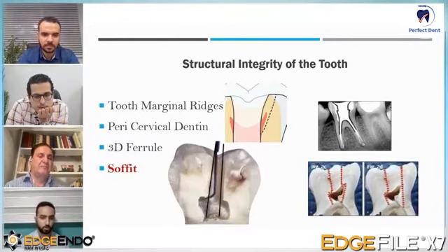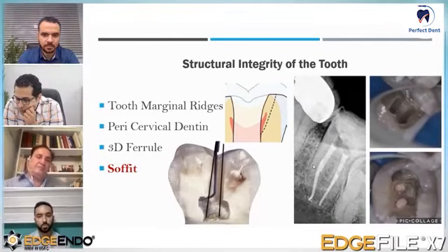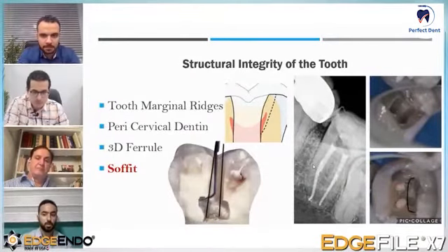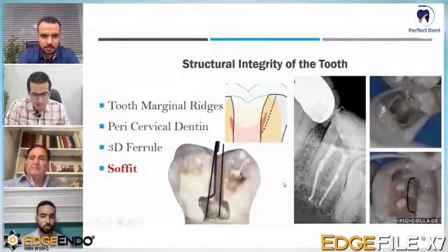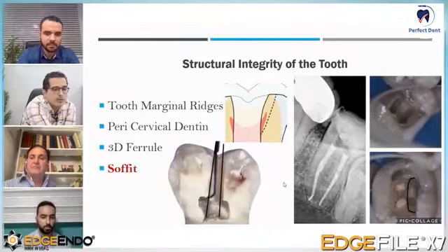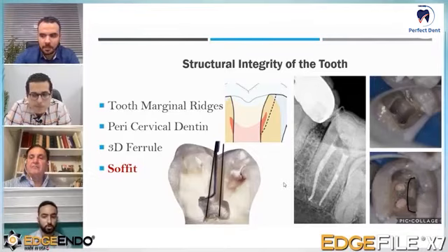So if you have a chance to preserve it and still have your straight line axis, it may preserve lots of dentine. Like for example, in this case, I had the lower second molar. I didn't know from the beginning if it's only 2 canals. So maybe if I know from the beginning, from a cone beam CT, I would have preserved this shaded area. But again, since you don't know, you don't have a preoperative cone beam CT, you can't risk leaving a part of your roof just to be minimally invasive on the expense of a hidden anatomy or a missed canal. So just maybe if I have a preoperative cone beam CT, I would have thought of preserving it to preserve dentine.